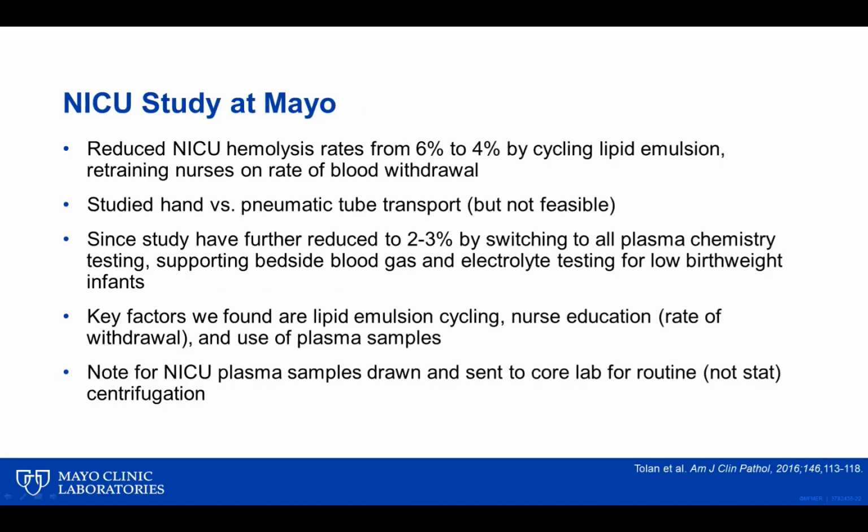Well, we performed a study at Mayo several years ago where we looked at all of these variables, and we were able to reduce the hemolysis rate from 6 to 4% by attempting to avoid our AM or routine draws during a time when lipid emulsions were being administered, and also by retraining nurses to slowly withdraw blood. All of this got us down to about a 4% hemolysis rate.